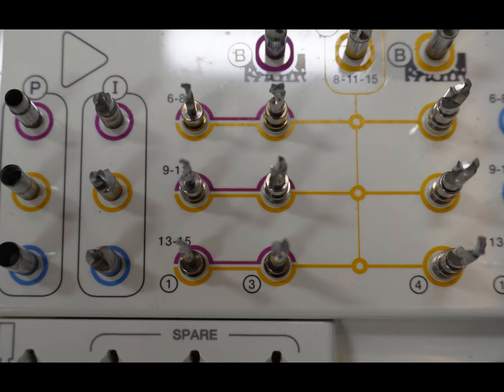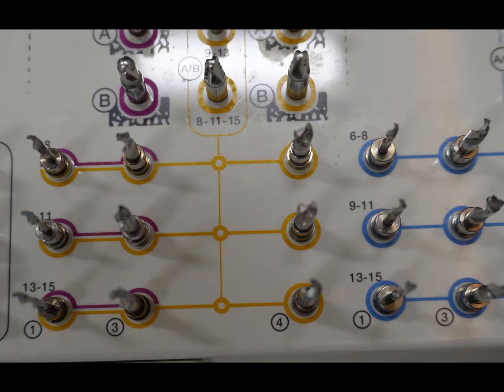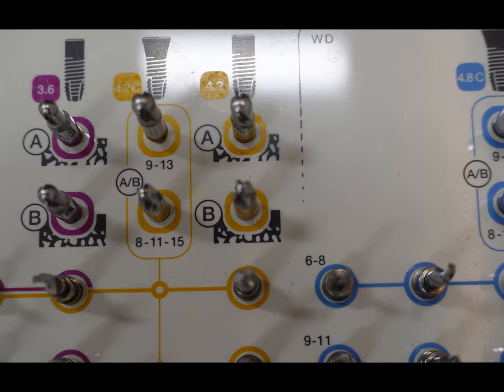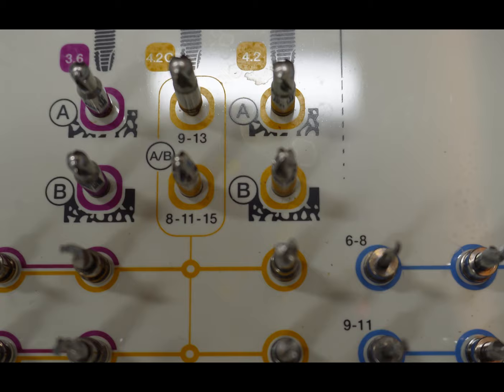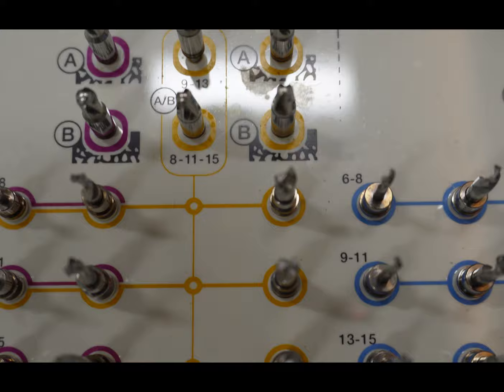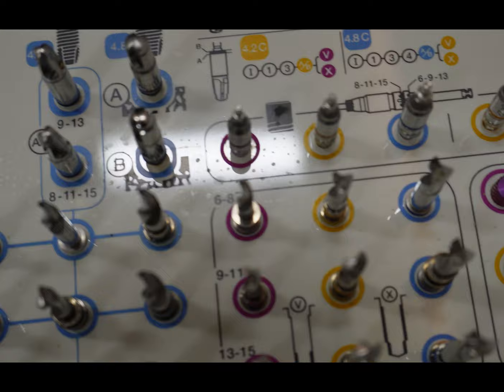Today we are placing an 11mm implant, and it is a 4.2, so we'll be following that yellow track with the 9 to 11 implants. As you come across that track we get to our final drill bit and we move up into the accessory burrs for the 4.2, which are A or B. For more dense bone we'll use the B in cortical bone, and for less dense cortical bone we use the A. The same applies for the 4.8s — A or B — based on either a 4.8 solid implant or a 4.8 conical implant.